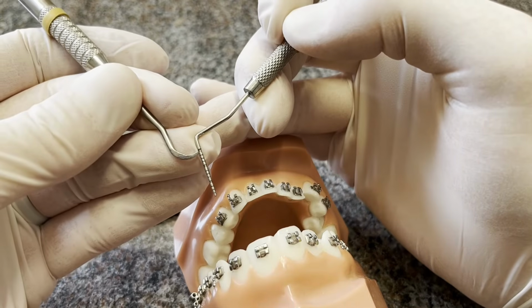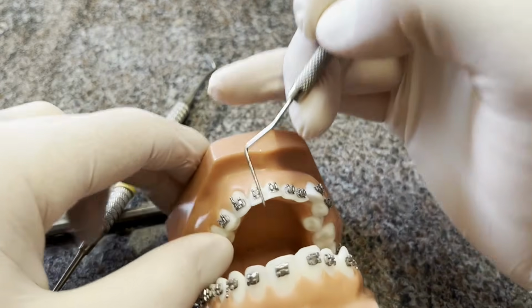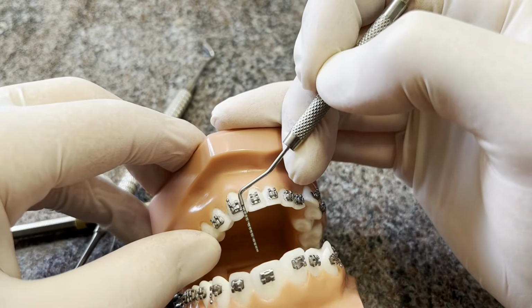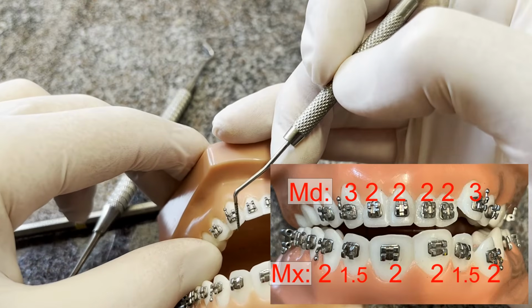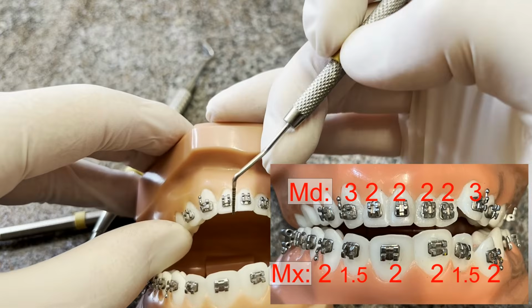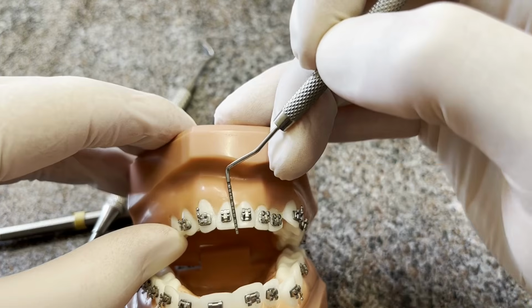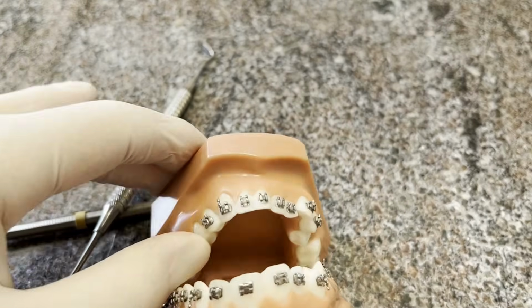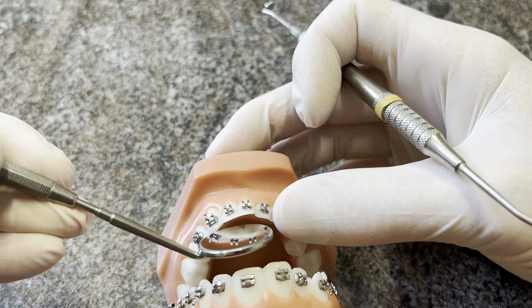From the bottom of this dark black line right here, I'll set that right on the edge of the top of the bracket, and then I want about 3 millimeters to the edge of the tooth. So I'll set it like this. And then these should be about 2 roughly, and you'll measure them in the same way. So about 2 millimeters from the edge. You'll check rotation by looking down the incisal edge like this.